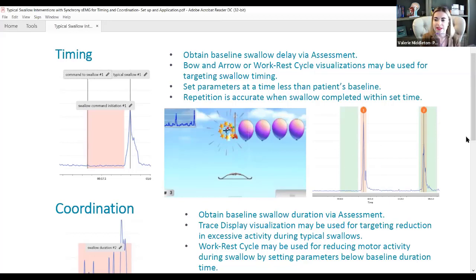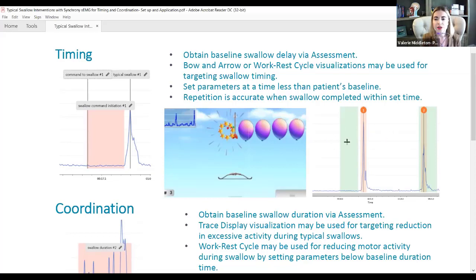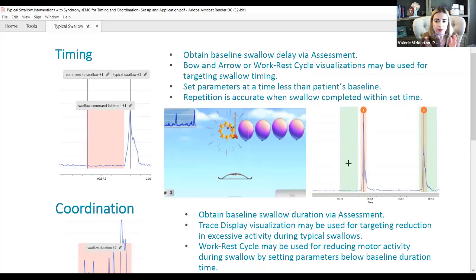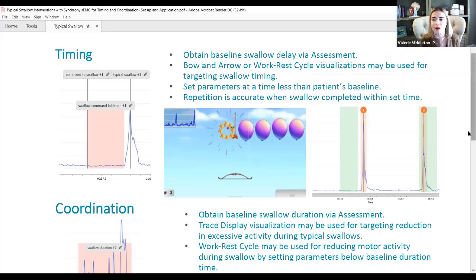We also have our work-rest cycle, which is very important for both timing and coordination. Instead of balloons, the timing of the swallow is represented by a green work column, with a white rest column. You can see a patient who swallowed outside of the green — they were delayed — versus a second repetition where they swallowed within the green, which would be timely and on target. If a patient had a five-second delay, we shorten the work cycle to two or three seconds so the patient must swallow before they exit the green.